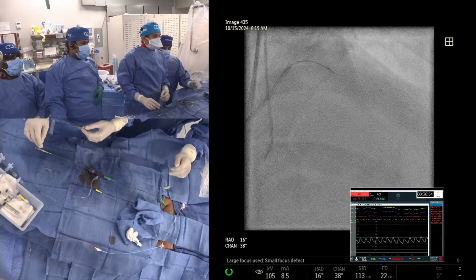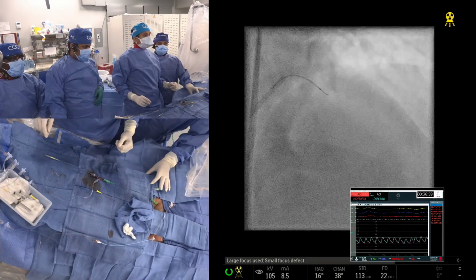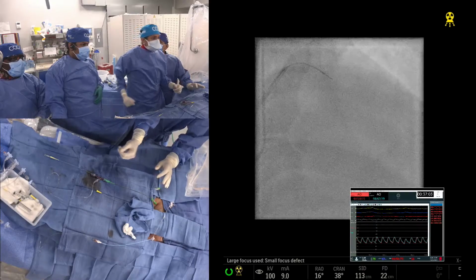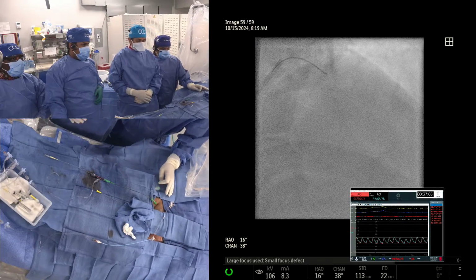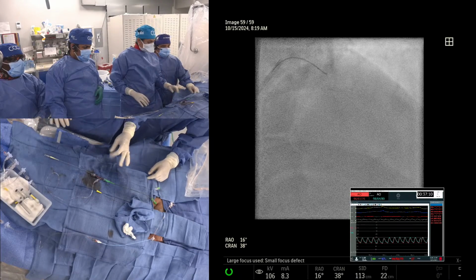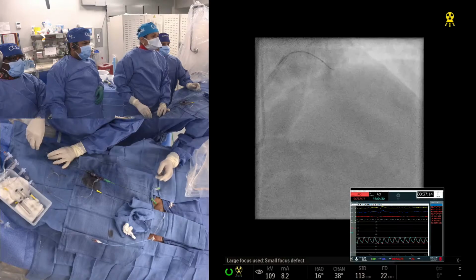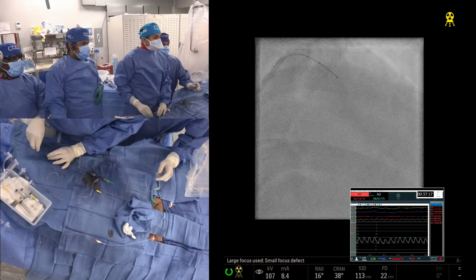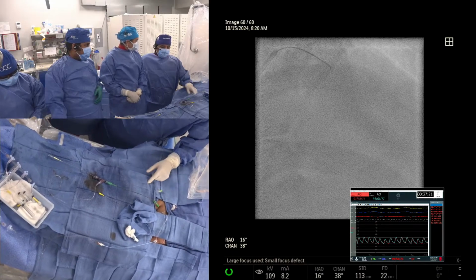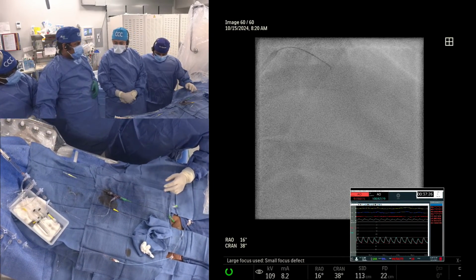Okay, tell us what you are doing now. I'm just trying to tell Samir how to decrease the radiation. See, I've got the collimators inside now. Look, this is the single easiest and most effective way to reduce radiation, which people don't use. And I'm so glad you're doing it. Most of your cases you do in how many frames? 15 frames? Still 15, yeah. Excellent.